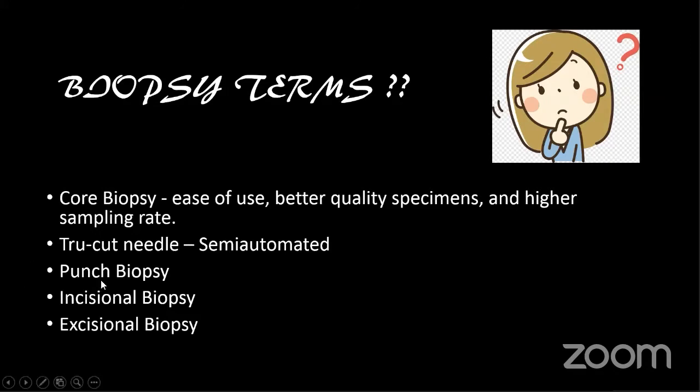Now, punch biopsies are performed by dermatologists for skin. There is a special punch biopsy forceps. And incisional and excisional biopsies, of course, are performed by surgeons whenever they need to take out the whole lesion. But most of the times, ultrasound guided percutaneous biopsies suffice.